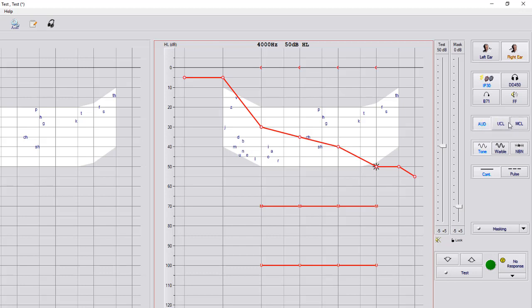Below your audiometry, you see on MCL you have tone, warble, and narrow band noise. You can change these for this particular patient. It is not a default, and you have continuous and impulse options.